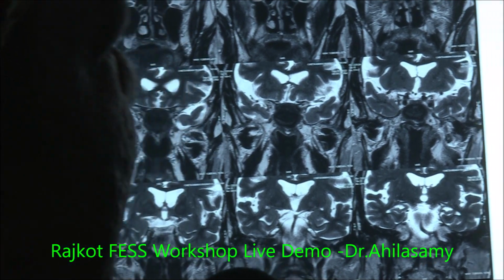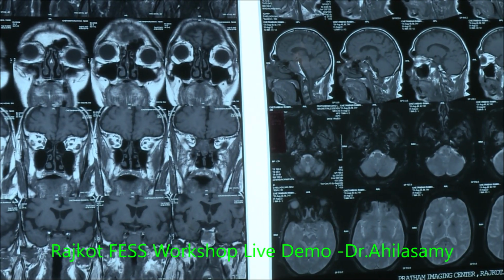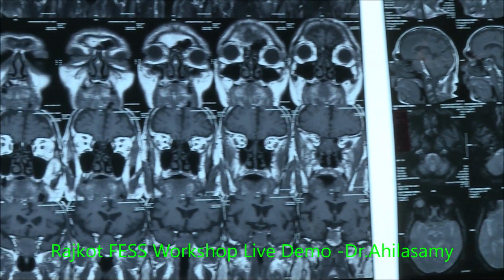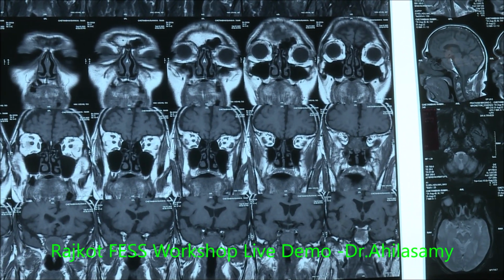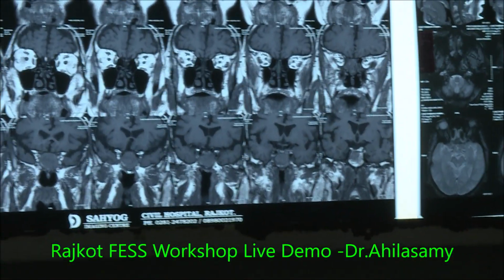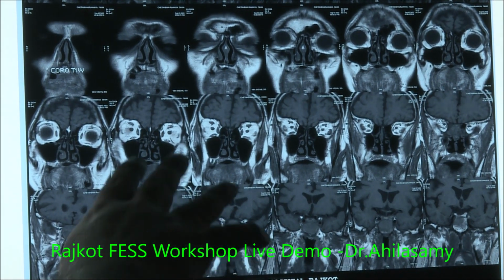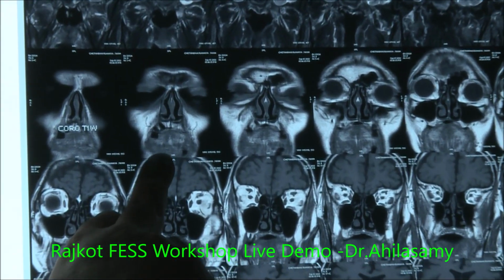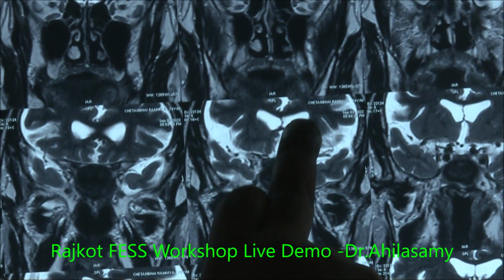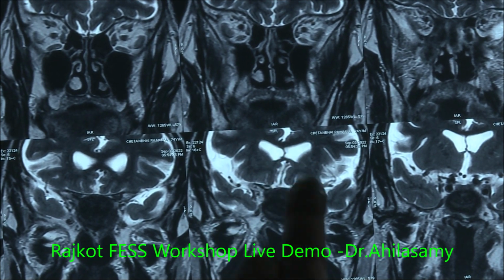Where are the CT pictures? Are you getting the images? Yes, sir. These are the MRI images. These are T1 images, where the CSF is black. This is a T2 image, where the CSF is white.